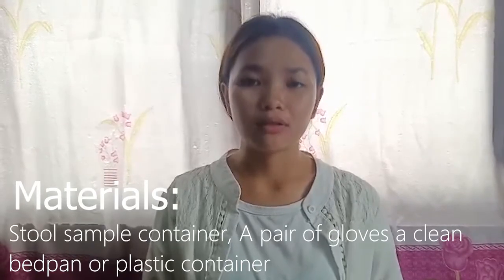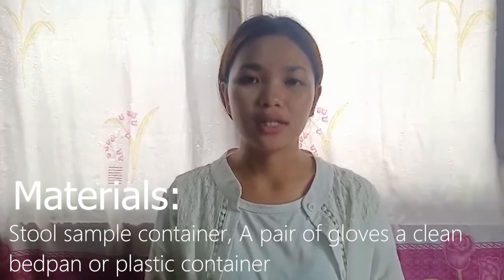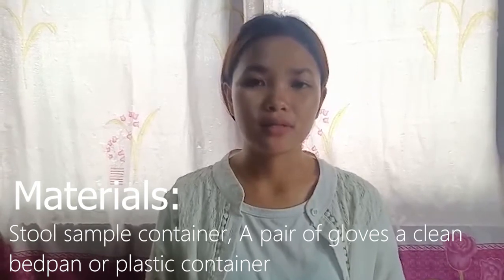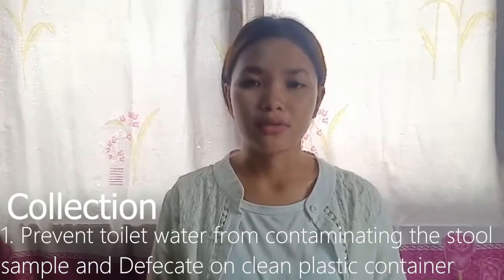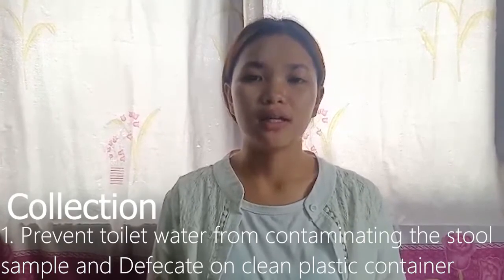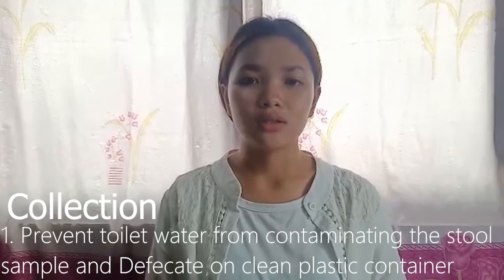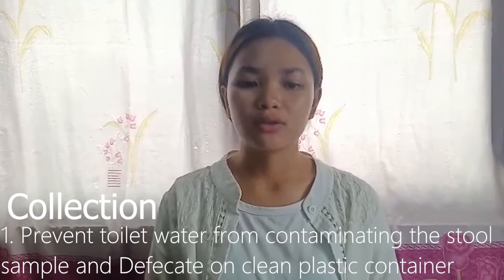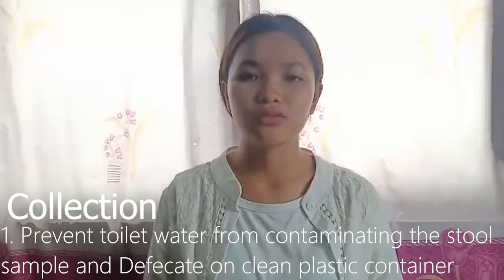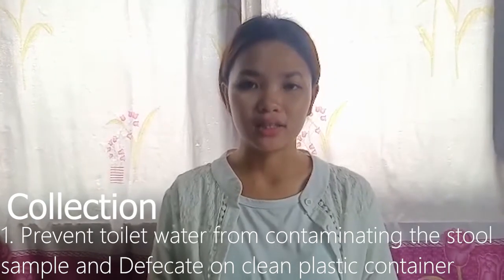So, in the collection, before you begin the specimen collection, you will need a few things: a stool sample container from the laboratory, a pair of gloves, and a clean bedpan or plastic container. These things you will need in the procedure. The first one is to prevent toilet water from contaminating the stool sample. It is important to defecate on a clean, dry bedpan or plastic container.